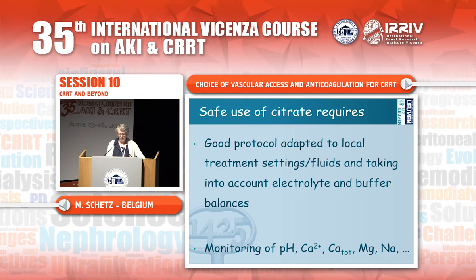You should adapt the buffer content of the replacement fluid because citrate is a buffer, and so on. And this protocol should, of course, be strictly applied, including monitoring of pH, total and ionized calcium, magnesium, and sodium.